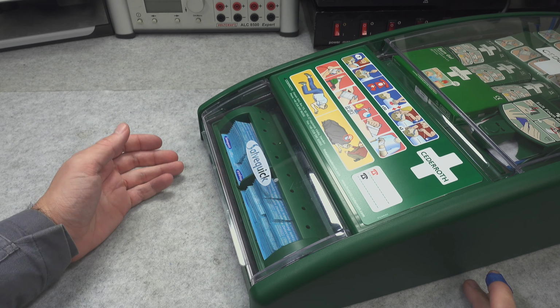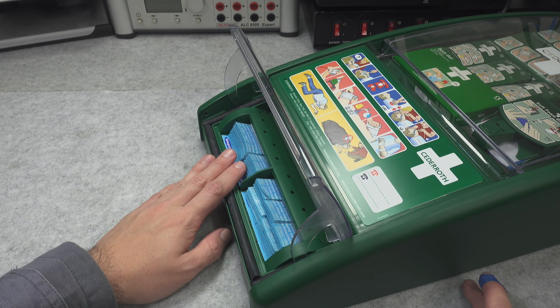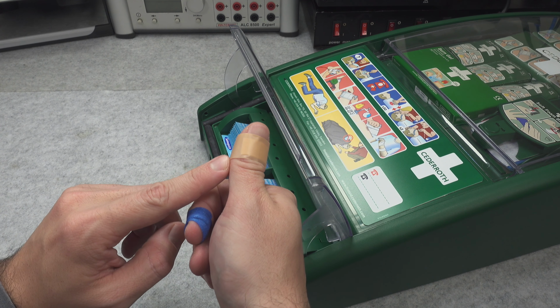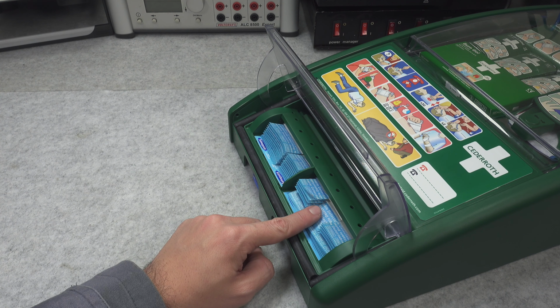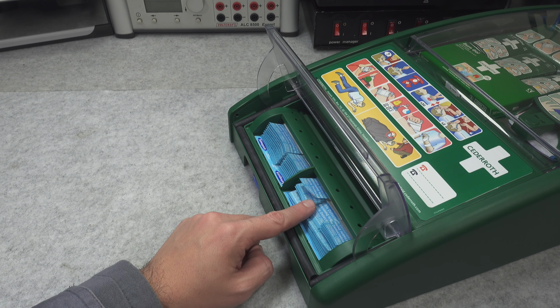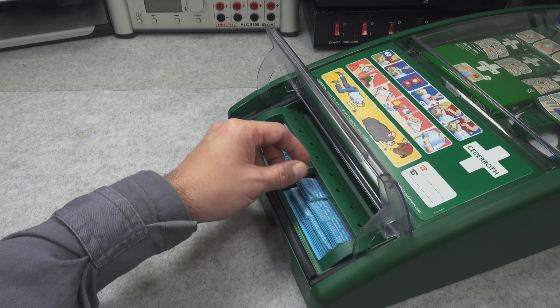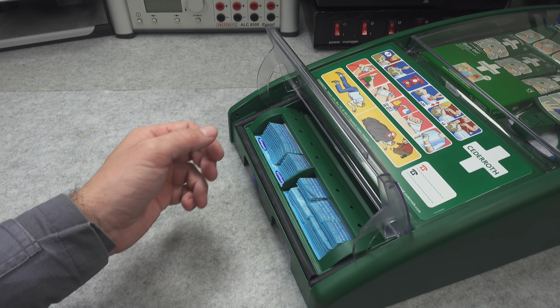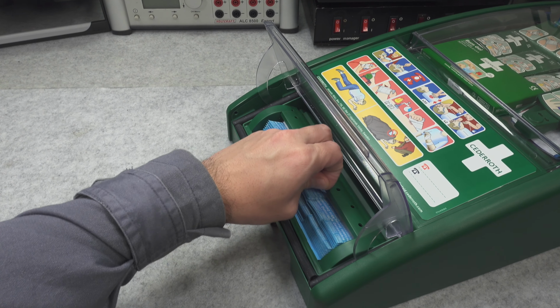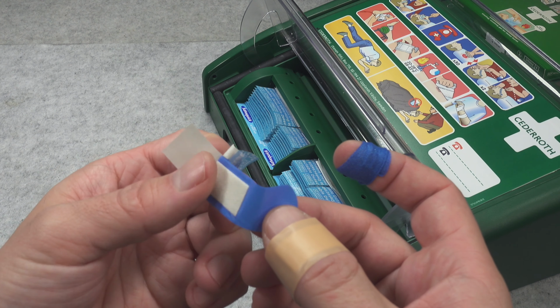And now we go into another difference, and here we've got our bandages, but they are very special and they are blue. Here you can see that I've got a skin color one, and you might ask yourself, what does the blue mean? Blue color means that inside we've got a metal film that makes them detectable in metal detectors. Mostly it is used in the food industry. So if someone is working with that type of bandage, and if it falls into food that is being processed, when the food passes a scanner, the metal detector will start beeping and they can halt the process.